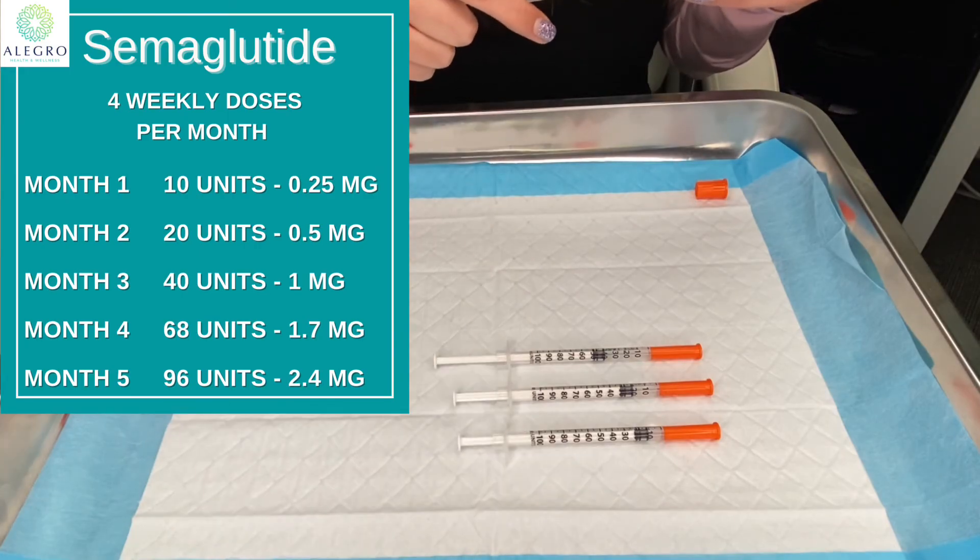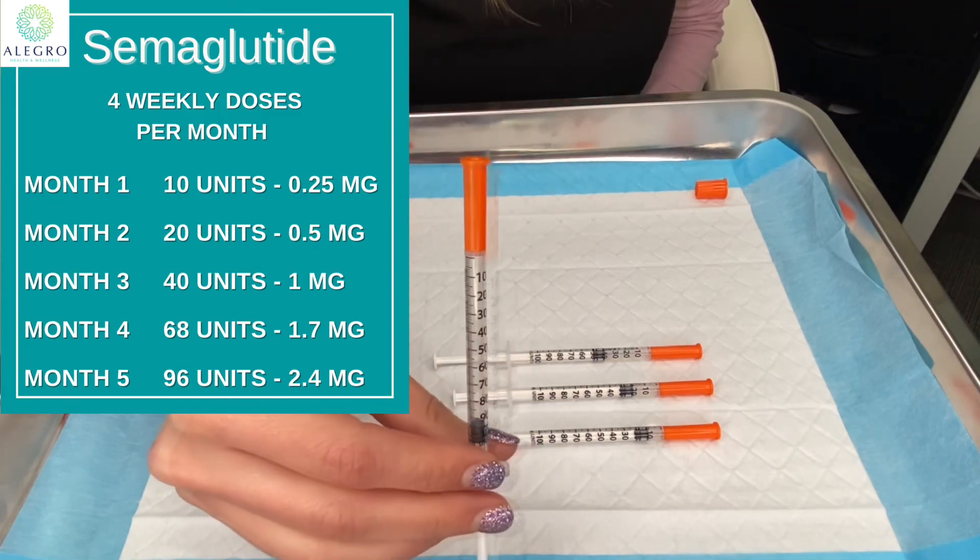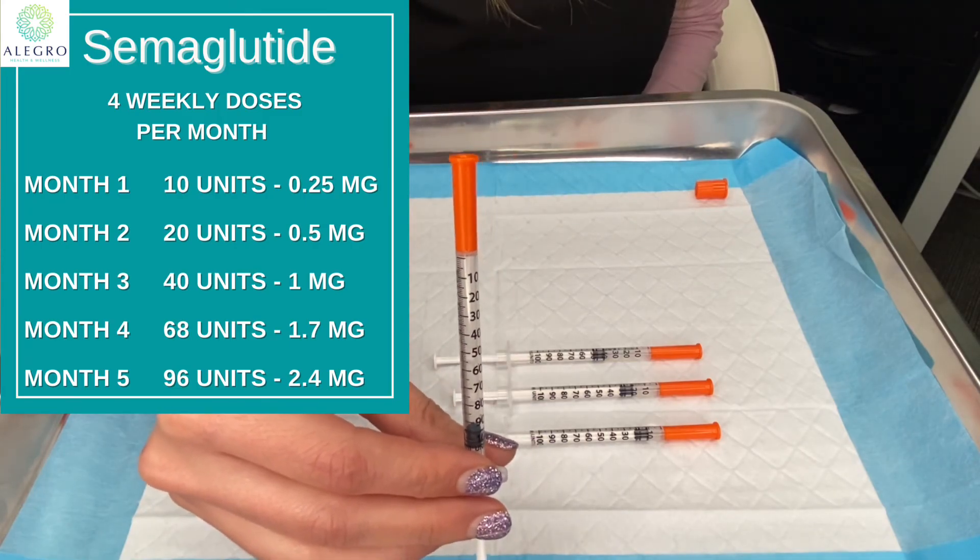For the 2.4 milligram dose, that is at the 96 unit line — that's what that would look like for the fifth month.